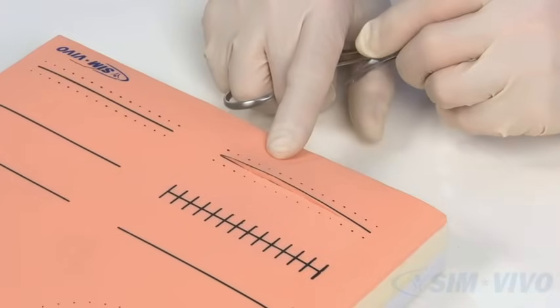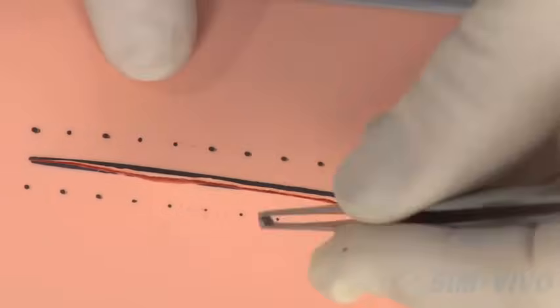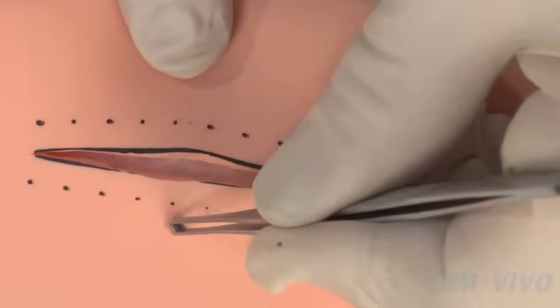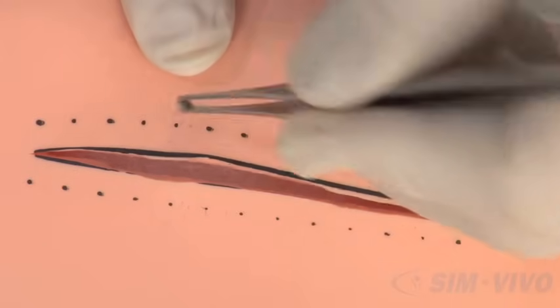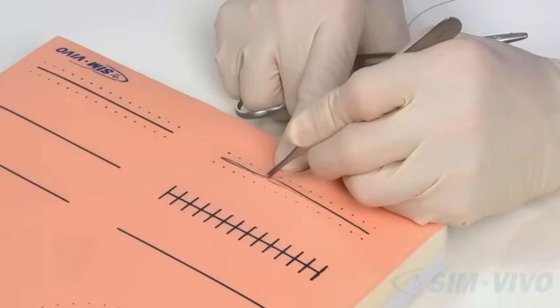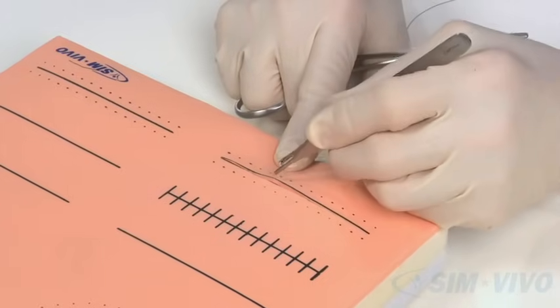In order to treat this, surgeons developed the vertical mattress suture, which we're going to demonstrate. The purpose of a vertical mattress suture is to use a large bite far away from the wound to bring the wound together, then a small bite to approximate the edges of the skin.